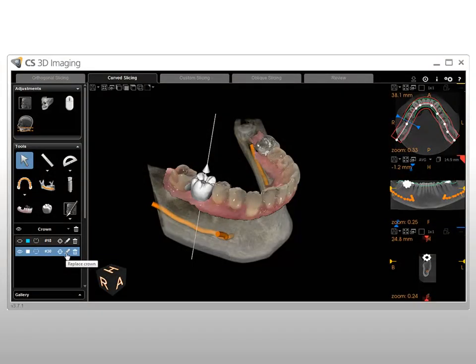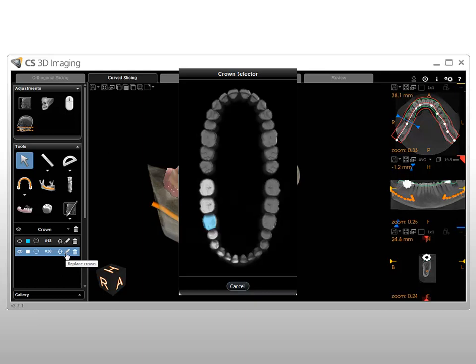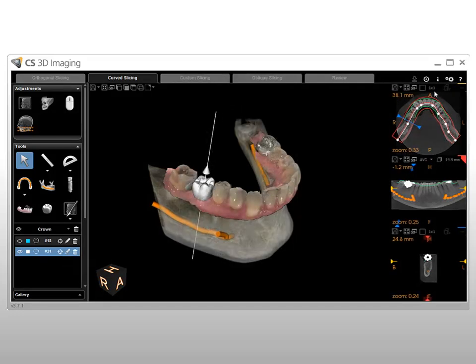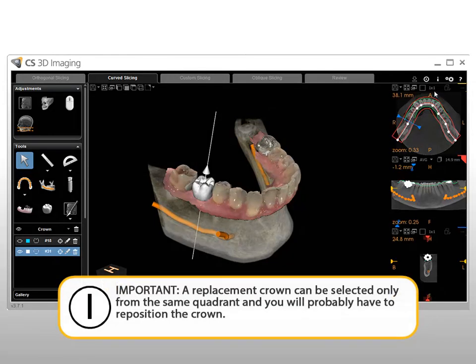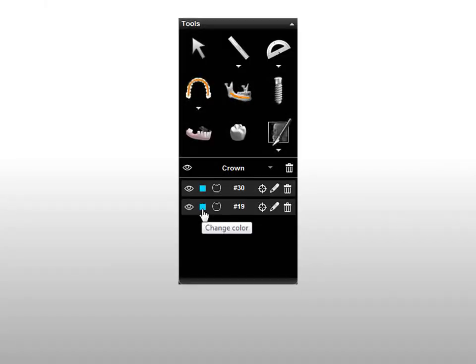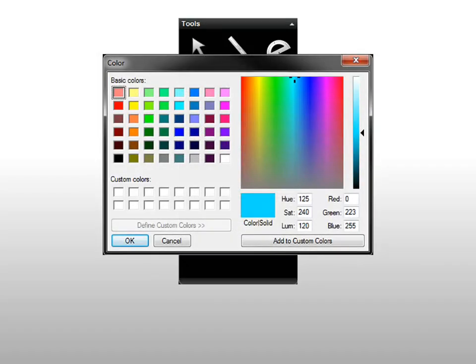To replace an existing crown, click the pencil. The Crown Selector window is displayed and the crown you want to replace is highlighted. Select the new crown you want to use and it is replaced in the Curve Slicing tab view screens. Important: a replacement crown can be selected only from the same quadrant, and you will probably have to reposition the crown. To change the color of a crown, select the color box, choose a color in the color selection window, and click OK.